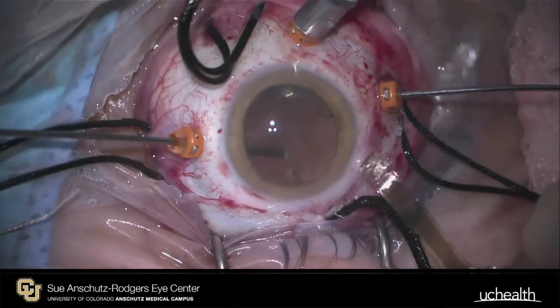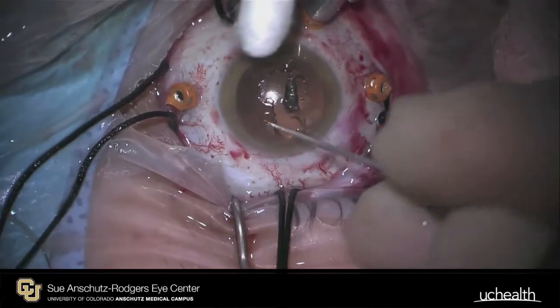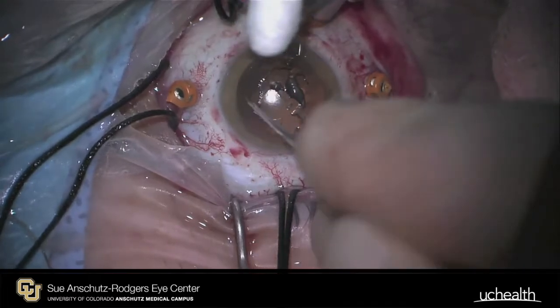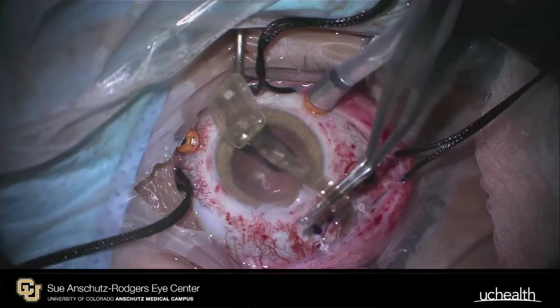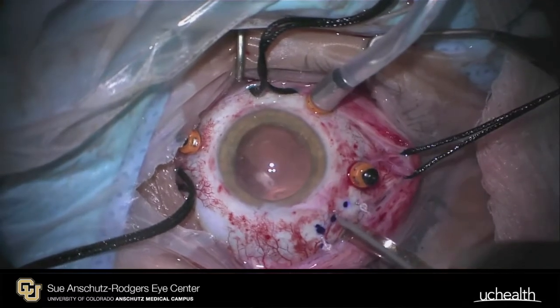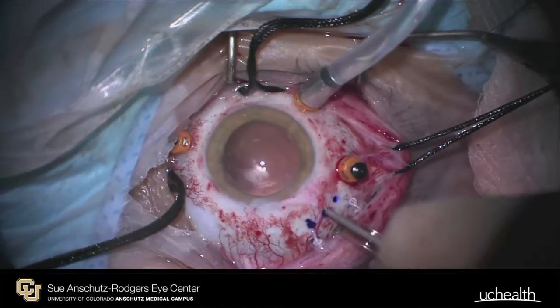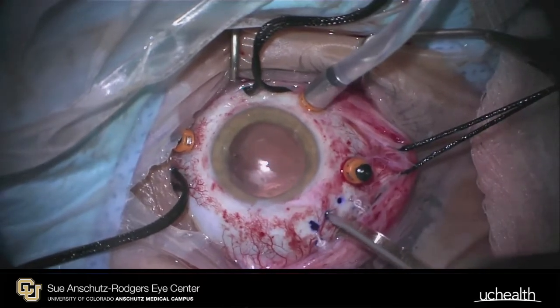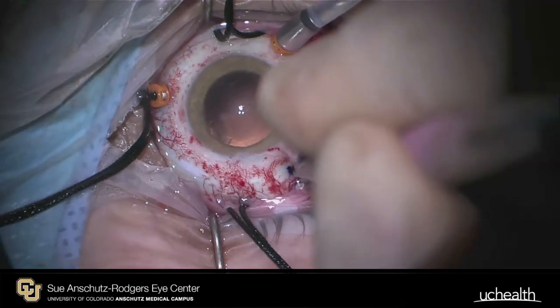For phacic patients, a pars plana lensectomy is then performed in a standard fashion, taking care to achieve complete zonulectomy and capsulectomy. Corneal epithelium can be debrided if necessary. Great care must be taken in manipulating the flat cable attached to the electrode array. An MVR blade is used to make a sclerotomy, which is then widened to an appropriate width using a shortcut blade.